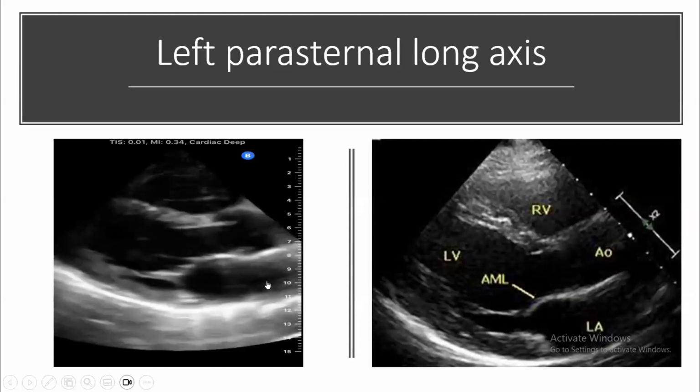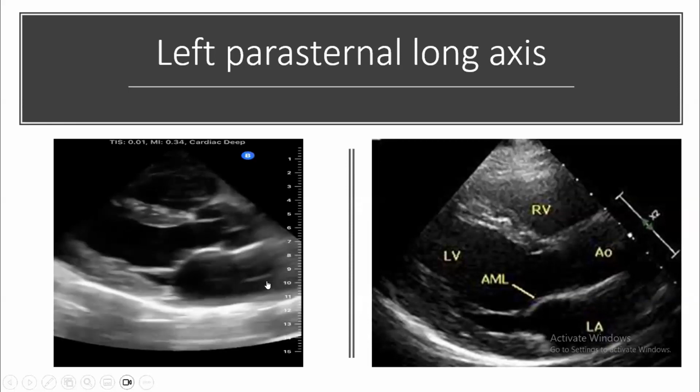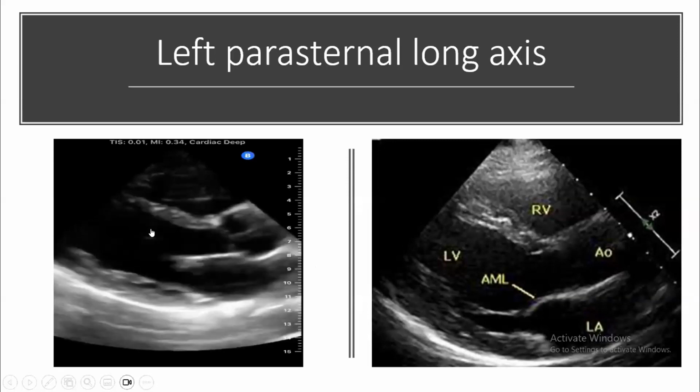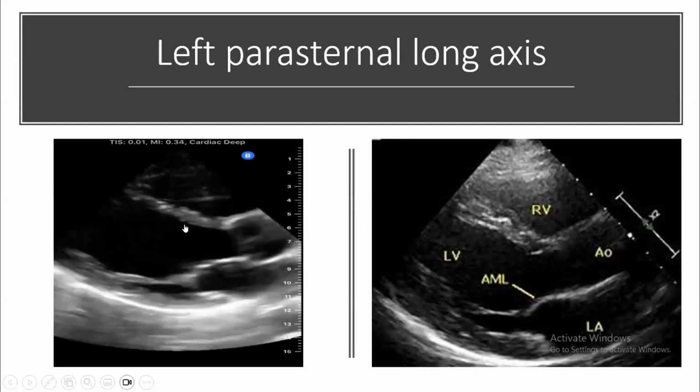As you can see, this is the normal contractility, and this is a very important sign, because when you assess the contractility of the left ventricle from the parasternal long axis, we are assessing the size, almost normal. Okay, it is not dilated. You will see the dilated one now.